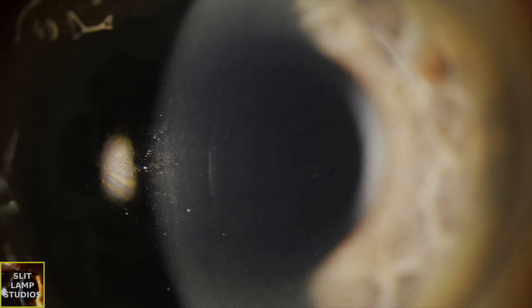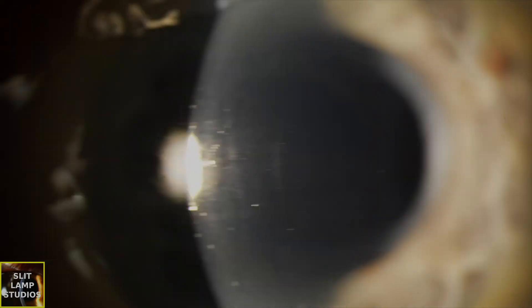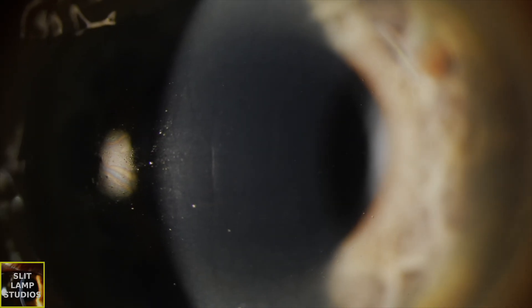We can see that these folds appear as multiple parallel intersecting lines on the corneal endothelium and Descemet's membrane. These folds occur due to wrinkling of Descemet's membrane caused by decreased intraocular pressure, resulting in decreased corneal rigidity and affected curvature.